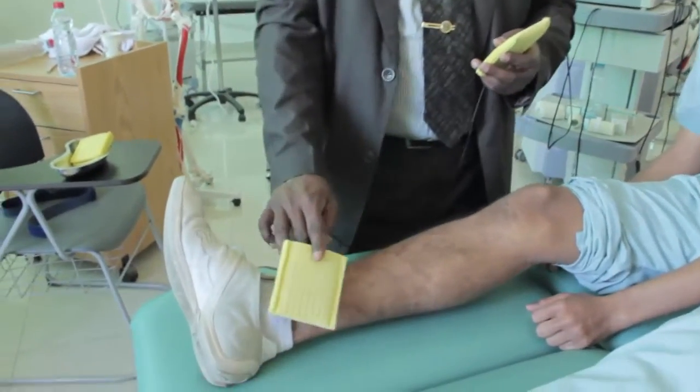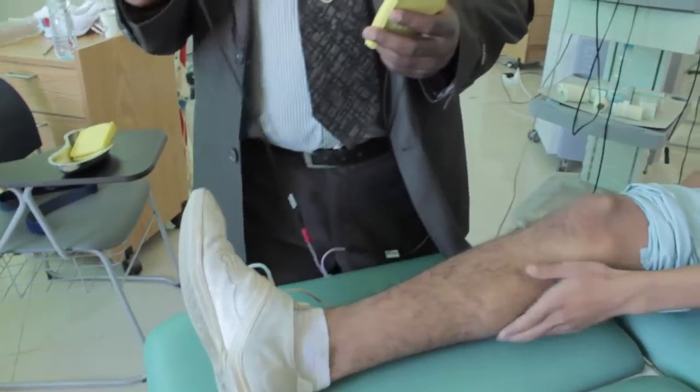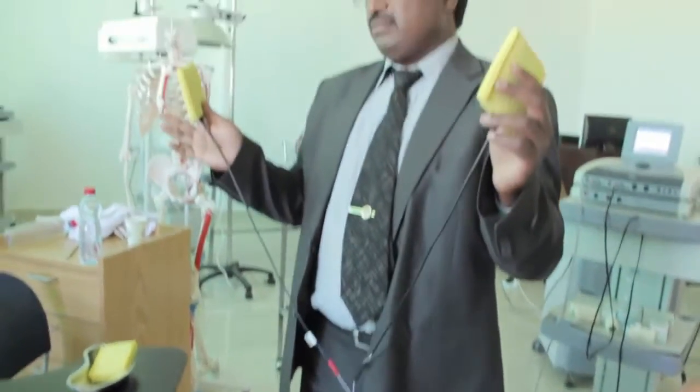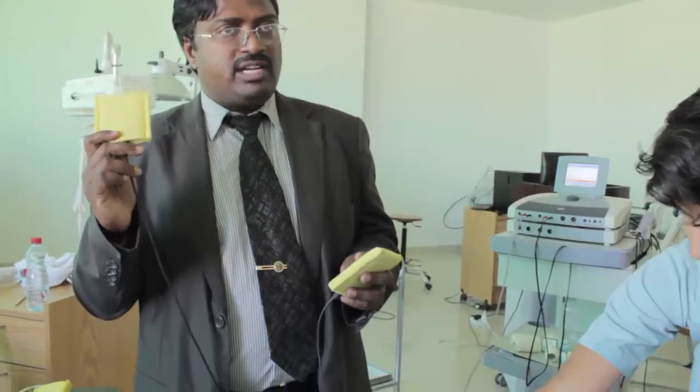Ankle injury is also the same. Wherever pain, there should be anode. If the ankle has pain and swelling, then keep cathode. If there is a swelling, please keep cathode. Okay?